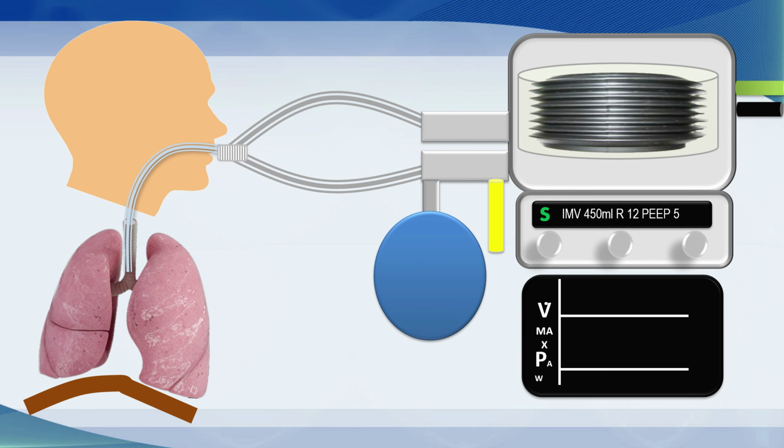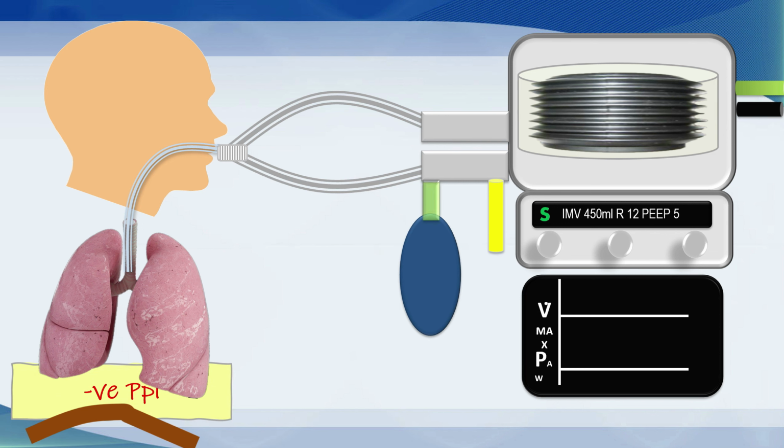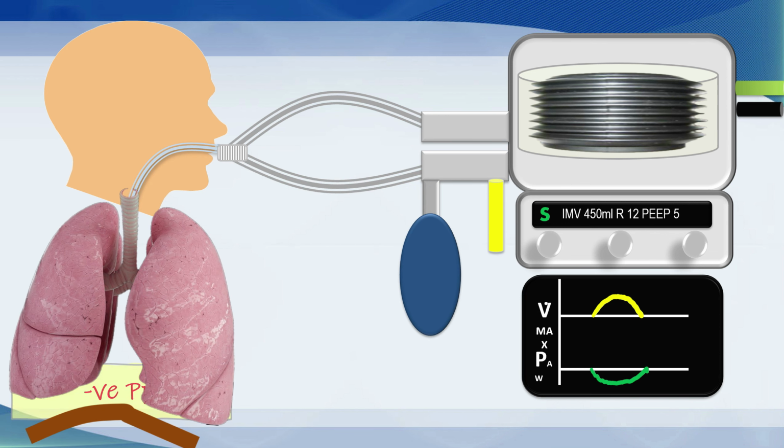Recall the problems associated with IMV ventilation, and indeed with anesthesia machines, where there is a significant amount of flow going past the tube, but when the patient needs to draw gas, they need to draw gas down the expiratory circuit and through a bag because their peak flow demands more gas than is coming specifically out of the outflow valve. So there has to be some kind of a reservoir, and that reservoir is the expiratory circuit and the bag. And that's a fair amount of work for the patient to generate if they're breathing through an endotracheal tube.